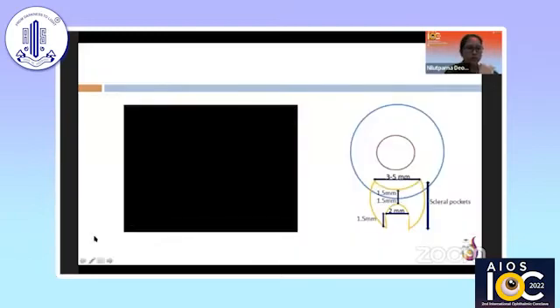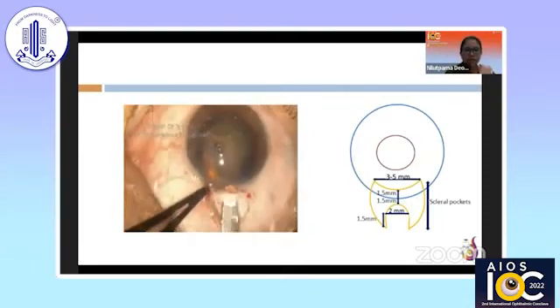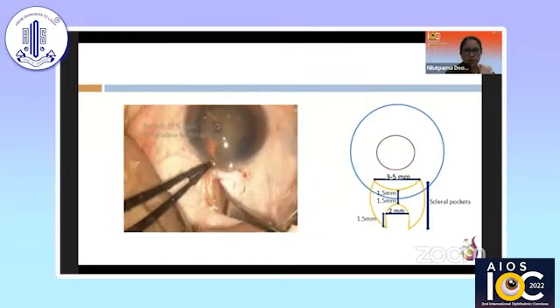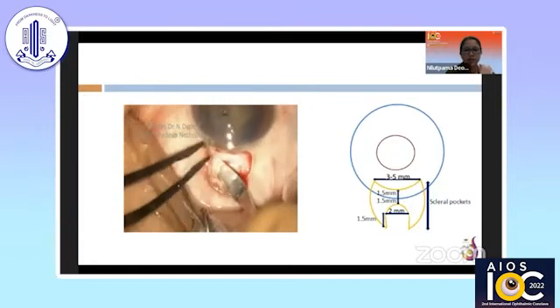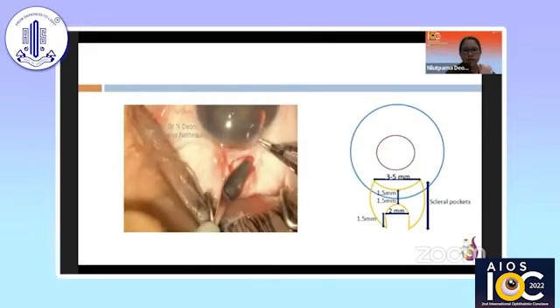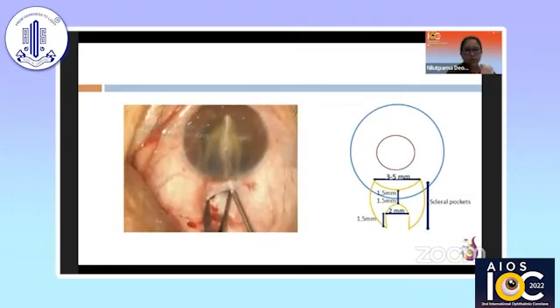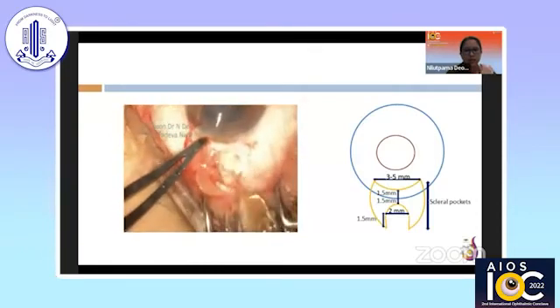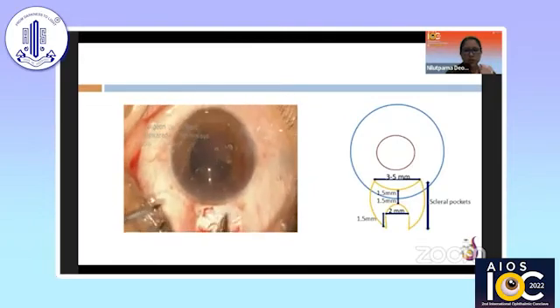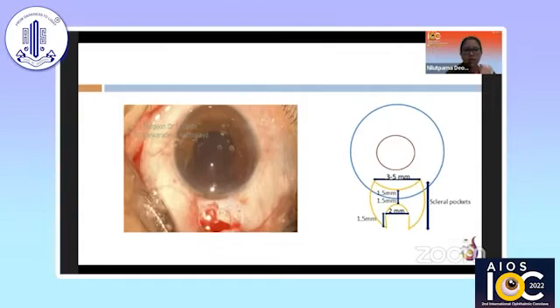Now I would like to show what should actually be done with the two millimeter incision. Having placed a two millimeter incision 1.5 millimeters behind the limbus, we move on to the scleral pockets — 1.5 millimeters ahead — and this is the initial back cut that should be given before entering the AC. The scleral pockets are created on both sides up to the end of the 1.5 millimeter extensions. This gives a compressible floor for easy manipulation, and you can see the nucleus now actually glides out without causing a purse-string effect. A hypotenuse of around 5 millimeters is created by the 2 millimeter incision and the 1.5 millimeter back cut, which helps us implant even a PMMA IOL through this 2 millimeter incision, limiting the scleral tunnel to 2 millimeters only.